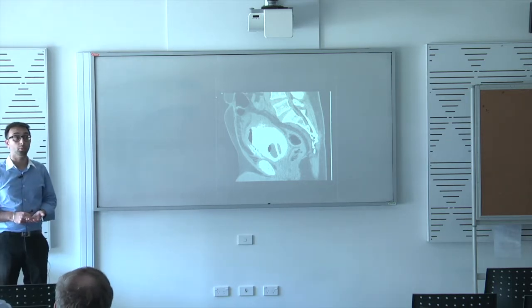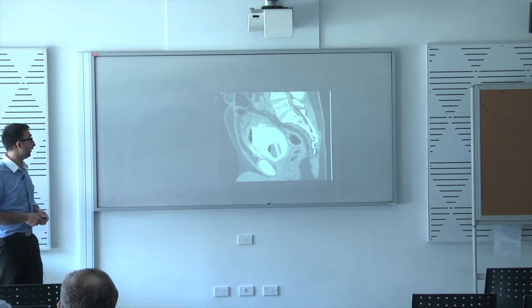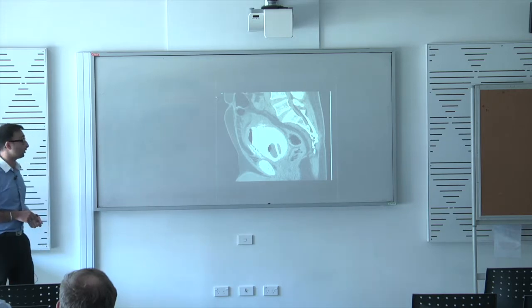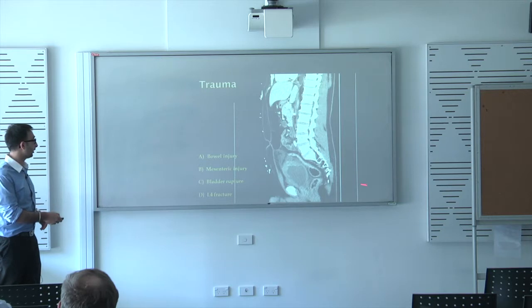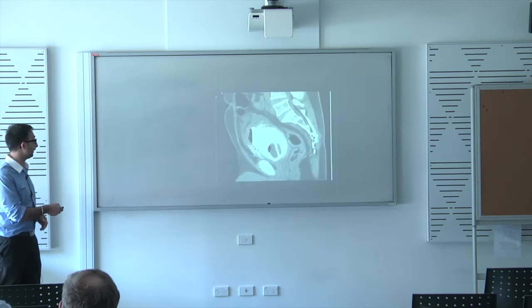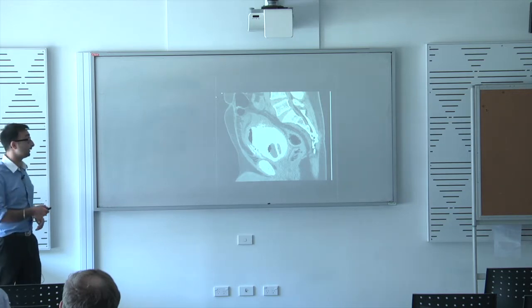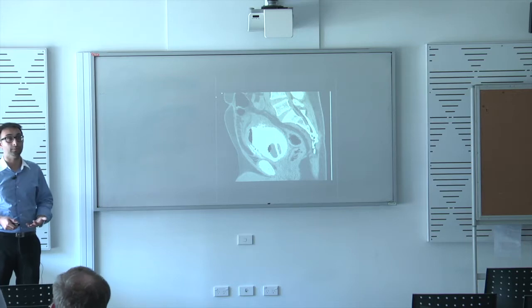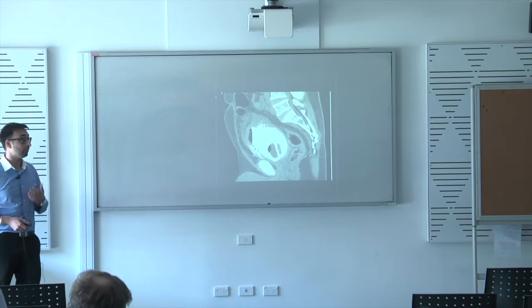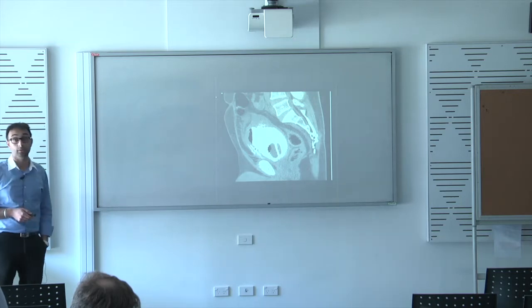And the two main important types with a bladder rupture are whether it's extraperitoneal or intraperitoneal, and that changes management. In terms of CT, with extraperitoneal, you'll see fluid around the bladder, around the base of the bladder, and you wouldn't see it going up into the upper abdomen and around bowel loops. Intraperitoneal is when you get free fluid in the upper abdomen. You'd also get it through the mesentery of the small bowel. And sometimes you get a combined injury. I thought this was a combined injury, but it ended up being an extraperitoneal one.